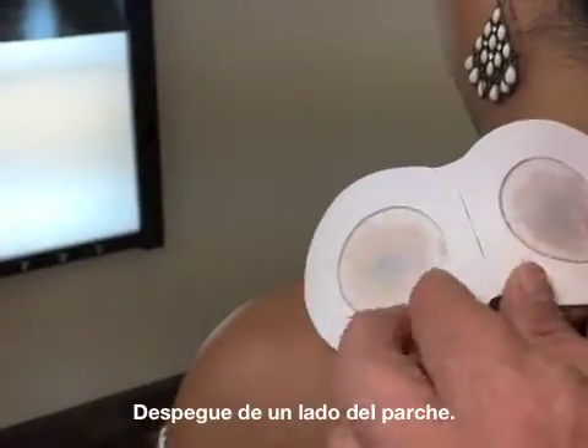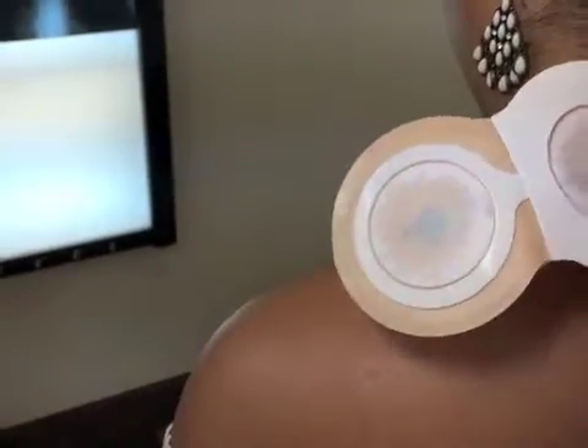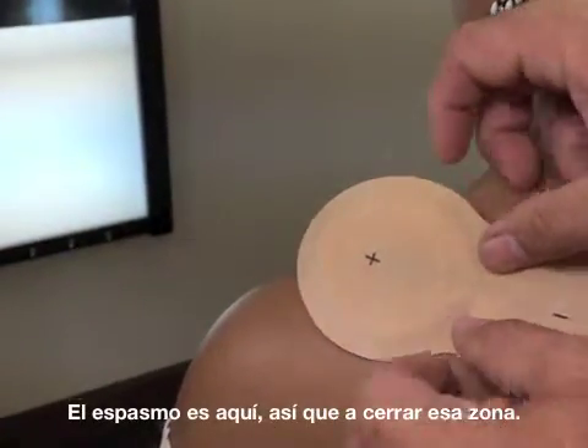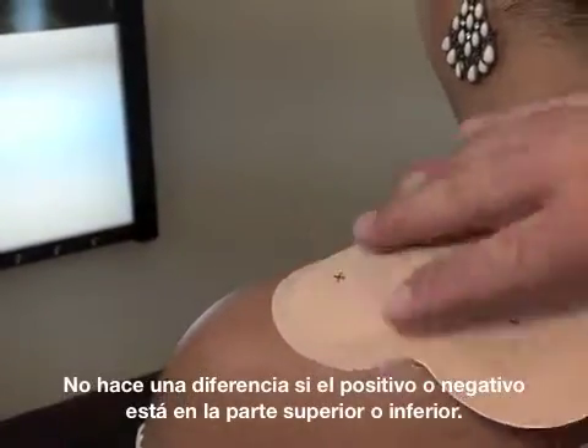We're going to peel off one side of the patch. The spasm would be here — we'll bridge that area. It doesn't make any difference if the positive or negative side is on top or bottom.